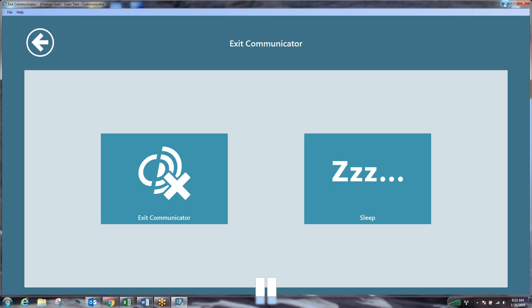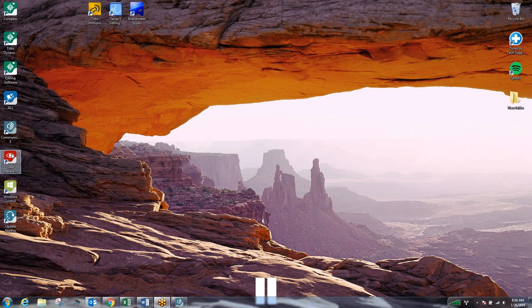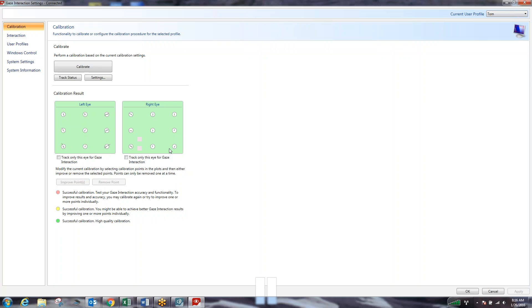I'm going to minimize my screen. And on your desktop, you will also see this red logo with a white eye. It's our Gaze Interaction logo. What I'm going to do is open that up.